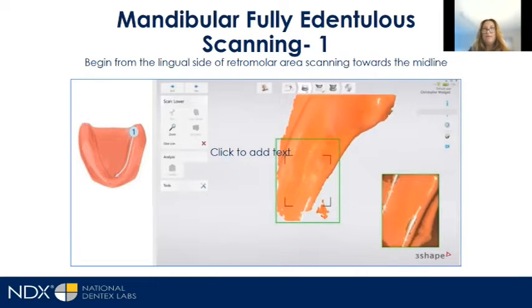If you did a wash on a lower, and they have a lot of ridge, sometimes trying to get the scanner into that section where your ridge is on the impression takes a little bit of manipulating of the scanner head to get into the lower area to fill it in. What you do is just hang out for a little bit and then move until it patches in, and then you keep doing that.